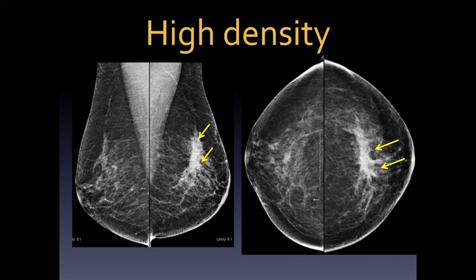Typically benign calcifications include skin, vascular, coarse or popcorn-like, rod-like, round, lucent-centered, eggshell or rim, milk of calcium, suture, and dystrophic. Here are examples of suture and dystrophic calcifications in a woman who previously had breast surgery — we don't need to worry about those. Skin calcifications are lucent-centered — you'll see small areas of lucency within the calcifications corresponding to where the hair follicle comes through. Also in this case is a very coarse popcorn-like calcification from a fibroadenoma — again, nothing to worry about.